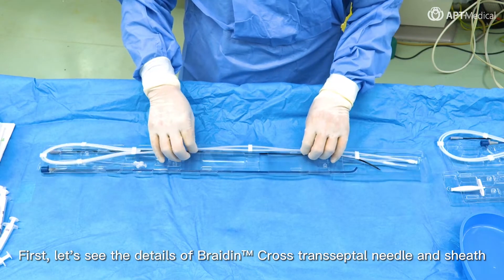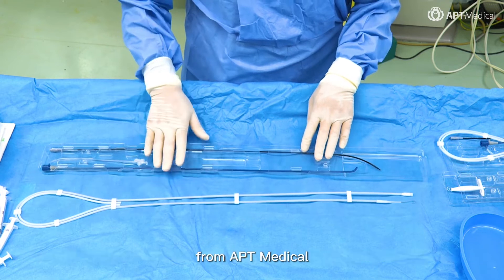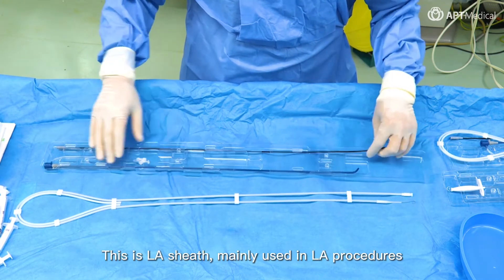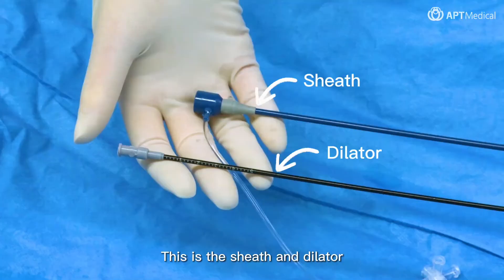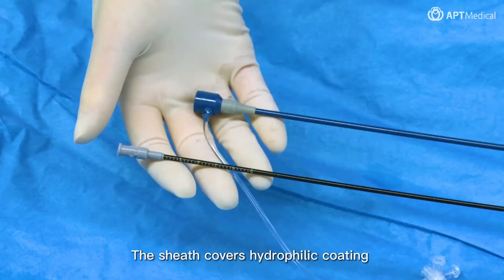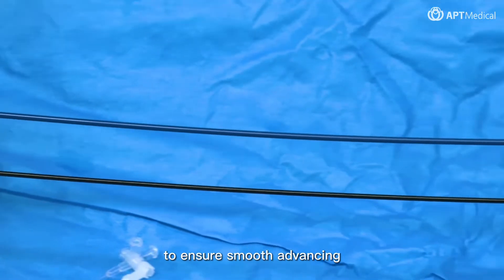First, let's see the details of Braden Cross transeptal needle and sheath from APT Medical. This is the LA sheath, mainly used in LA procedures. This is the sheath and dilator. The sheath covers hydrophilic coating to ensure smooth advancing.